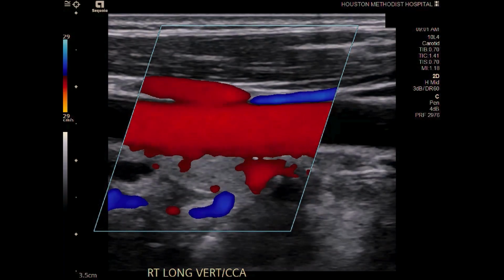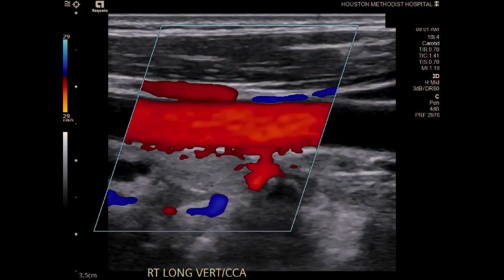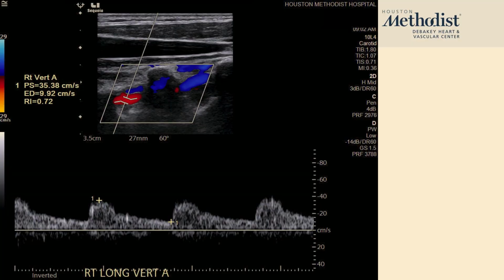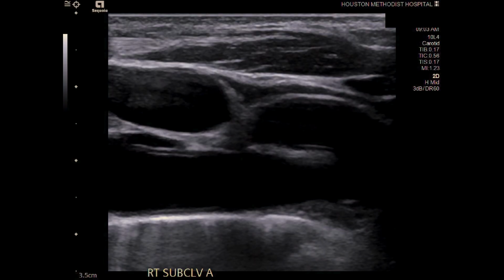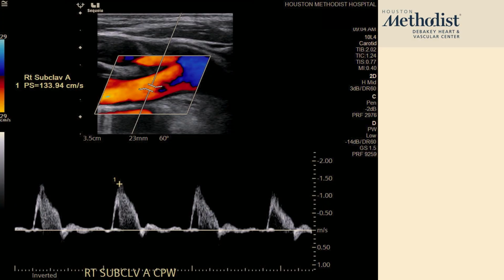And this is our clip when we're comparing the flow direction of the vertebral to the common. Again, another way you see the vertebral vein and the arteries opposite direction. That's one more confirmation. I see a low resistance antegrade flow in the vertebral artery. Again, my scale is showing me that the head is here, signal going away is red, and that's the flow direction towards the head, and the blue is the vein. We have one more picture for the subclavian, and the subclavian is under 200, triphasic waveform.